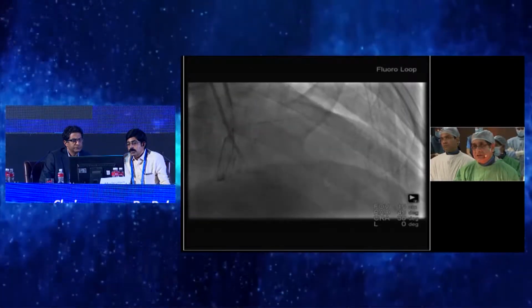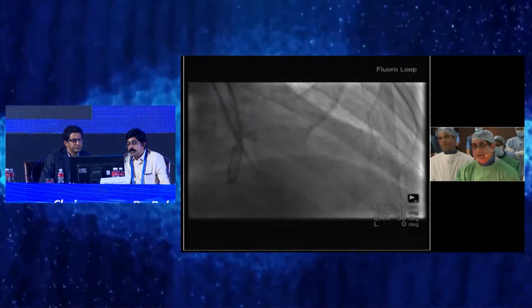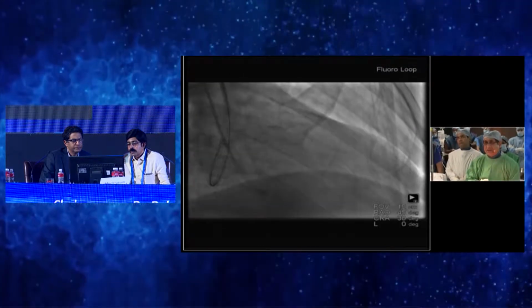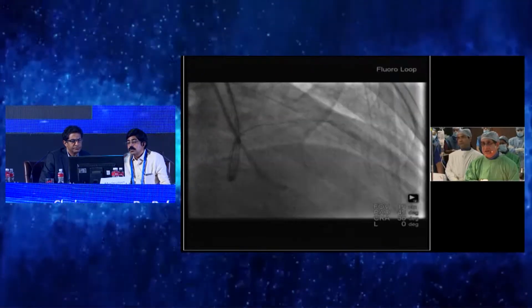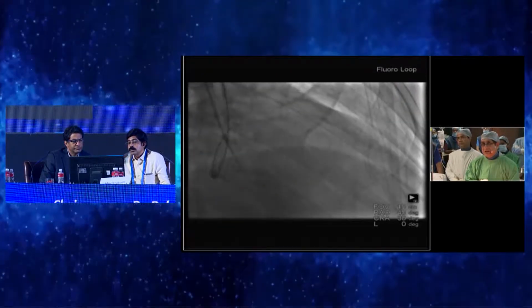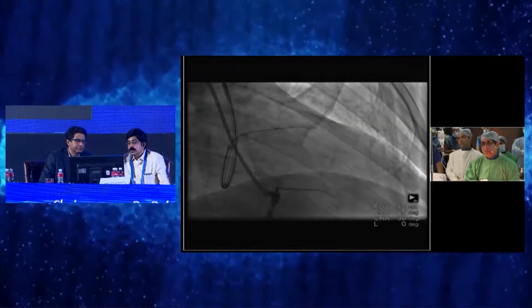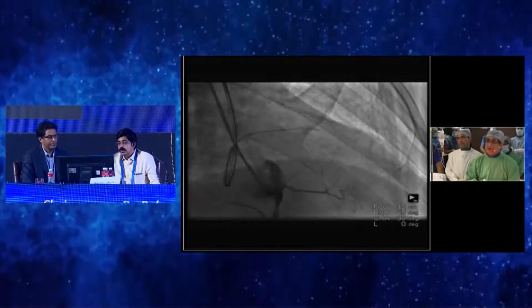And I have to just point it a little upwards. There, see, there. And there again it is bending, but I straighten it up, and see, there is a bend there. It slides over the bend like that, and it goes into the LAD. So next one, please. And then we take a picture, and we can see that we are in the lumen.